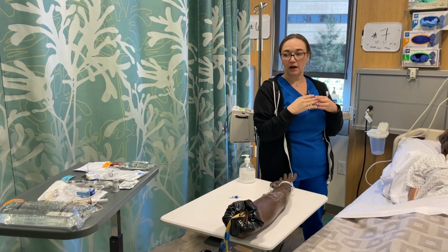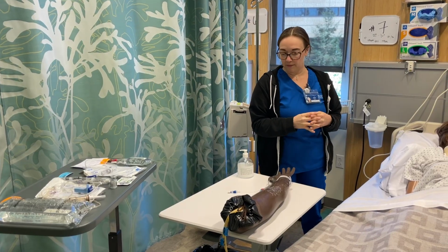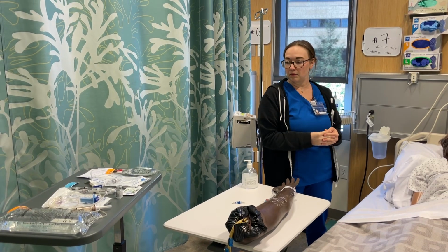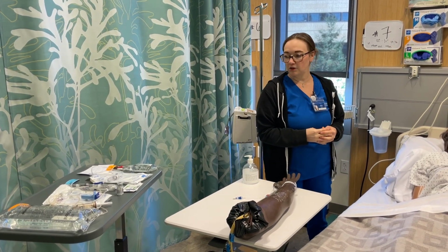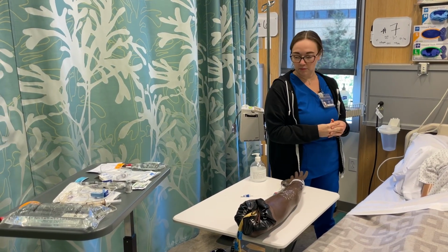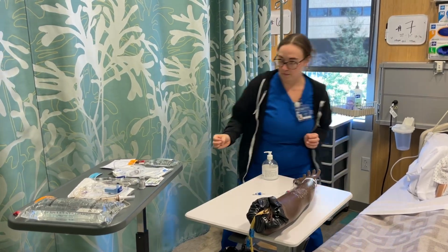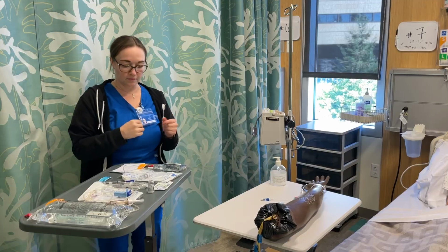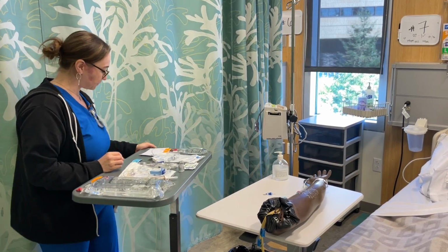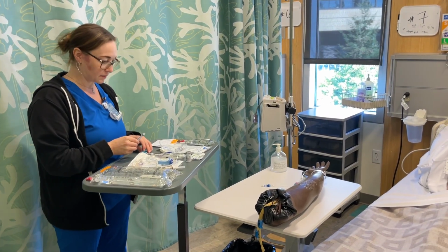In her chart, she does have an allergy to mangoes. So you're going to be getting your medication today. It's an antibiotic, and it could cause some nausea like you had last time. So we do have a medication for you that will make it so you don't have any nausea today, and I'll be giving that to you. Okay, and so here is the medication for that.